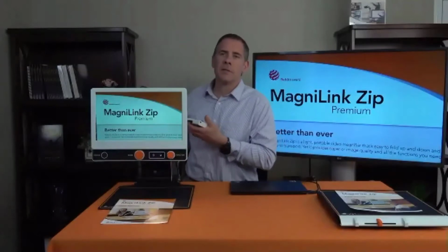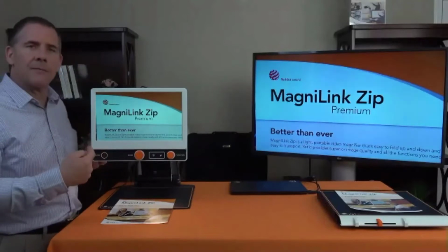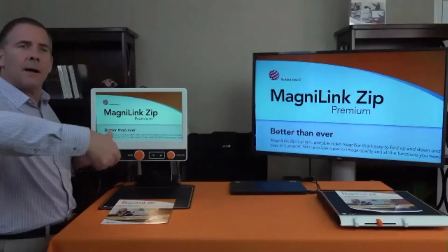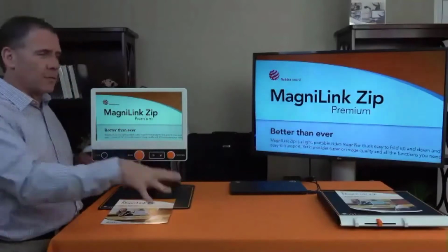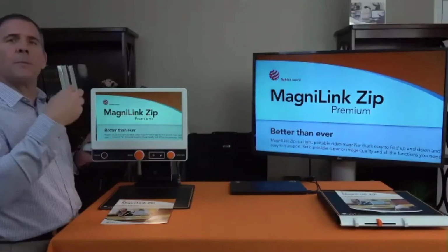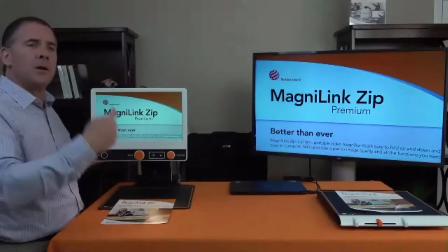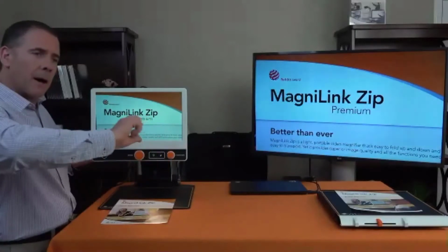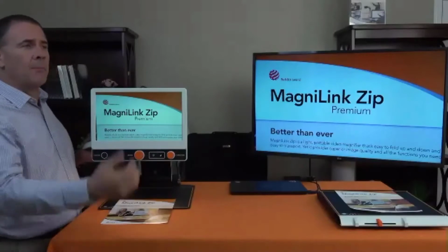So I'm going to come around the side a little and just tell you, on the front of the zip, to the left, I'm not sure if it's your right, but here, that's the power. In the middle is the magnification, and if I press the magnification button, it's a finder. It zooms out and then zooms back into the magnification I have. The next button over switches between color and contrast, and it's very tactile. And the next one over jumps through the contrast mode, all the different high contrast. And the next button here adjusts the brightness, or if I press it in, if I have the menu system turned on, it puts me into the menu system.